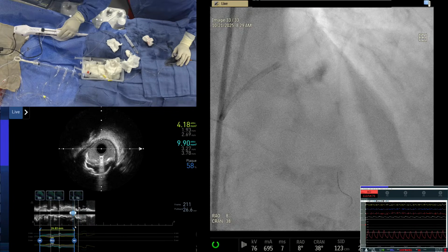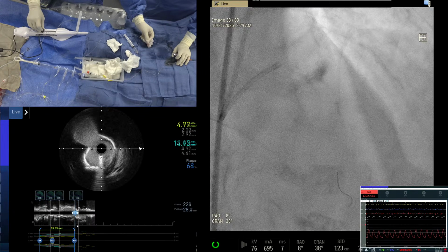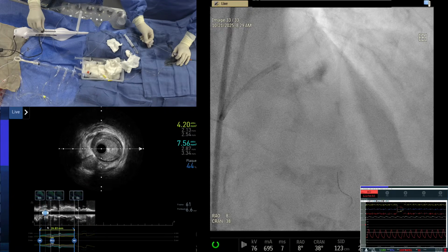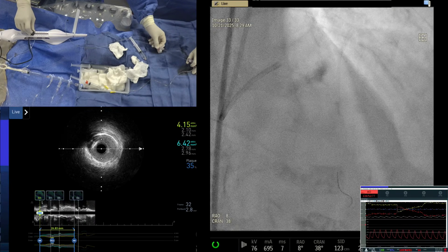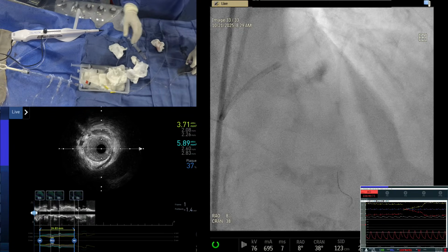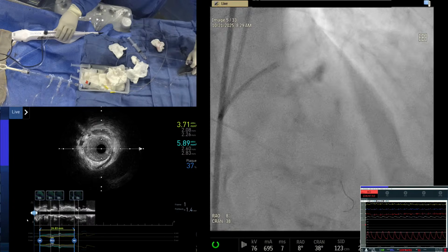Yeah. Going back one second, going back to our imaging, go to the distal part, because I suspect after the septal, I know there's disease, then is there a bridge? So not a clear bridge, but definitely there is a size gap. After the septal vessel, the size is like 2.75. Yeah, right. And Dr. Kenny, at the start of the pullback, I see some thin bridge. So it's true, there is a bridge. So at the start of the pullback point, there is a small bridge. Yeah, there is a small myocardial bridge.